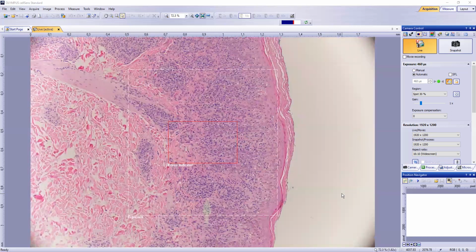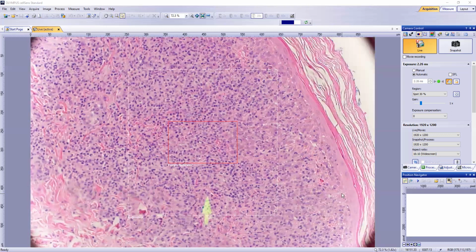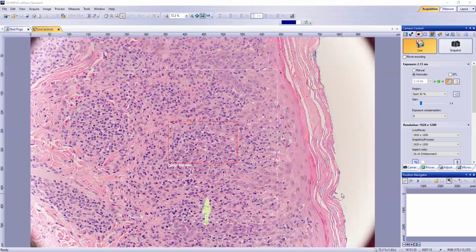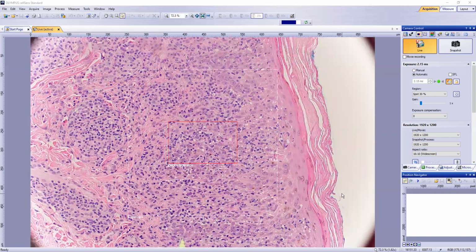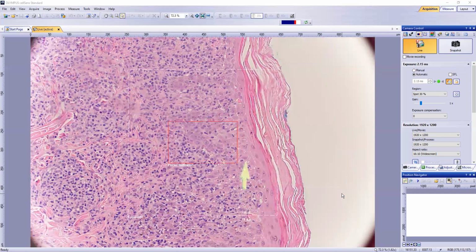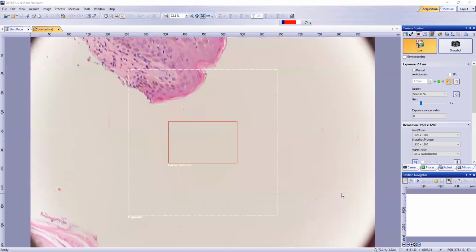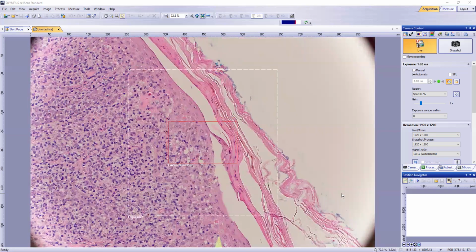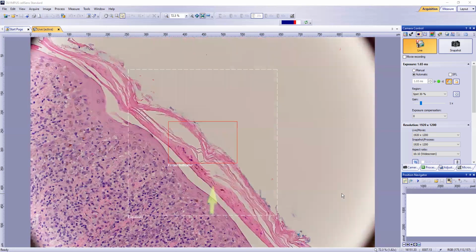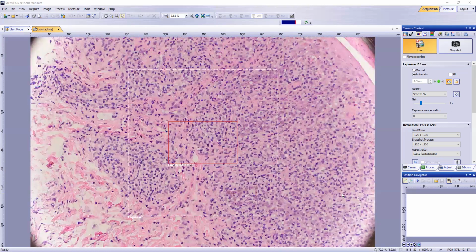Another characteristic feature: another thing you'll see are neutrophils. You can see neutrophils both in the epidermis as well as in the dermis in syphilis. So in syphilis, again, you do have the apoptotic keratinocytes because this is a lichenoid interface process. You will see some neutrophils, and if they're present, they'll usually be in the parakeratotic crust. So there are a few neutrophils in the crust here, and sometimes you'll see them even in the dermal infiltrate.